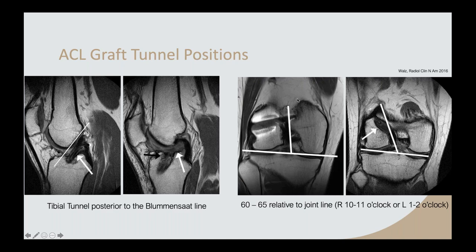Also, the femoral tunnel should have a slight angle, up to 11 o'clock or 1 o'clock, depending on left and right, to allow for some more stability. If it's more vertical, there's really not much stability being produced.